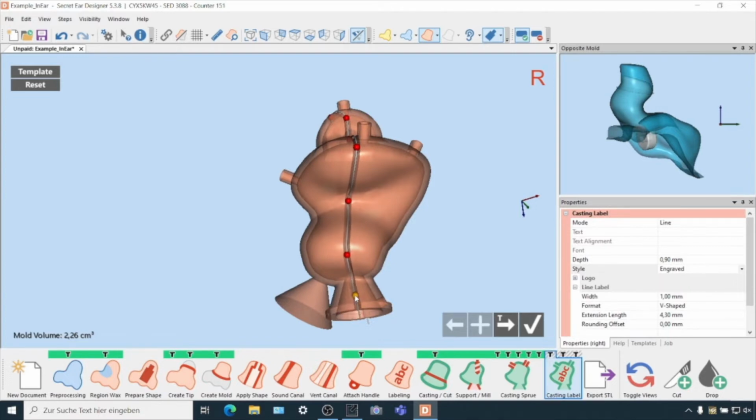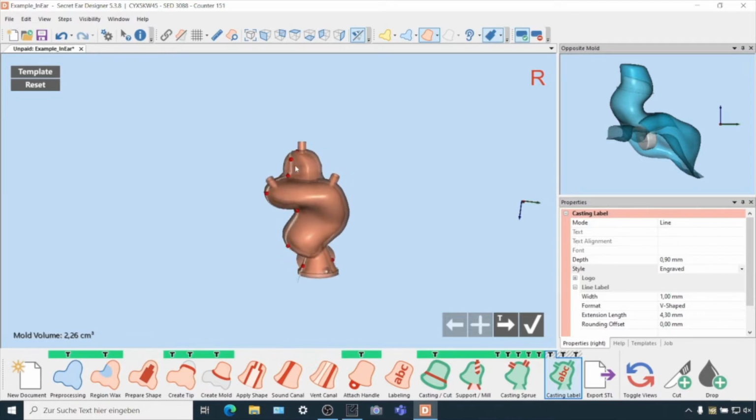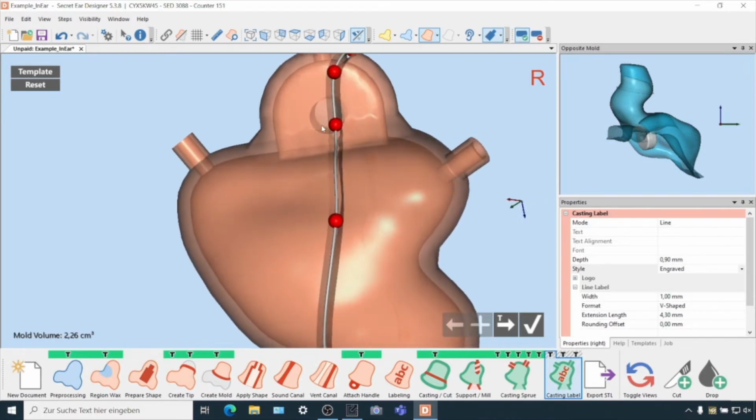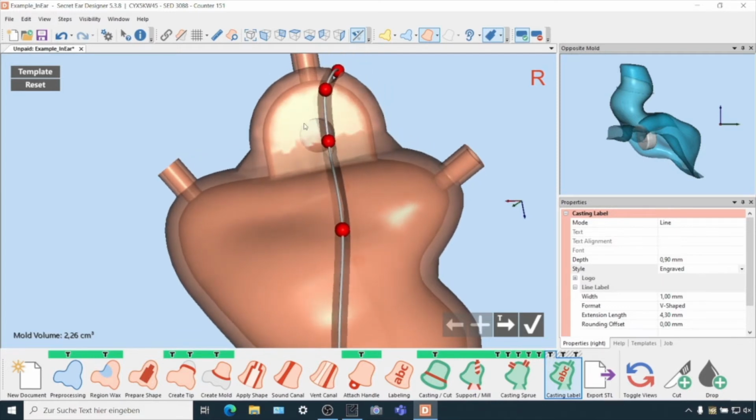And now you can see here the direction is nearly in the middle of the object. And also in the handle here, you need to know this part is massive later. This is filled with Cocoon material. That means I set the line here, then it's much easier later to open it in this area.